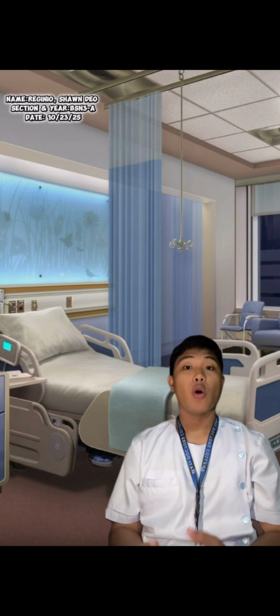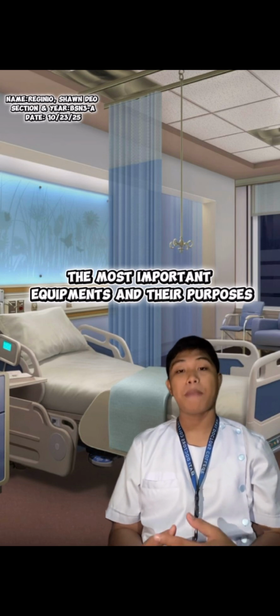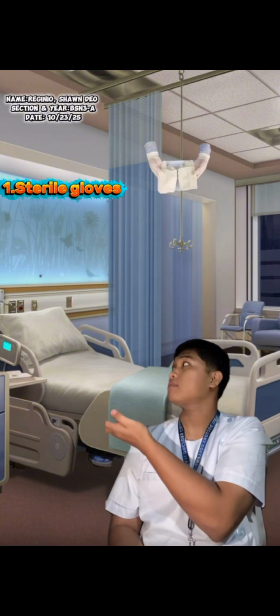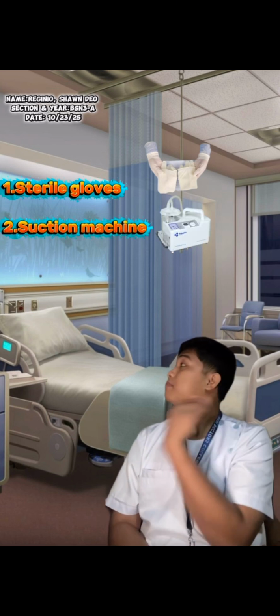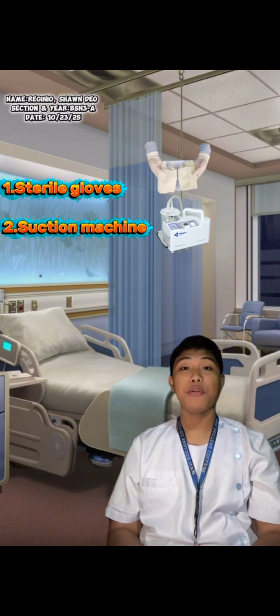Now, we have the five equipment and their purposes. In doing tracheostomy care, we need equipment. First, we have sterile gloves to keep both the nurse and the patient safe from germs. Second, we have a suction machine to remove the mucus or secretion that blocks the airway.